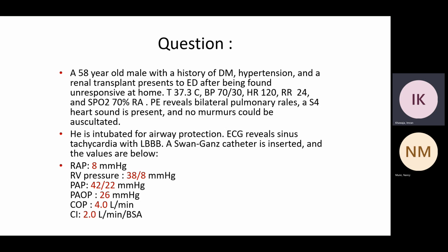So back to the stem of the question here, what they're describing. The patient is in heart failure, pulmonary edema, someone hypoxic with risk factors and crackles. And it looks like there's a new left bundle branch block. So you have to be careful here, someone with left bundle branch block.